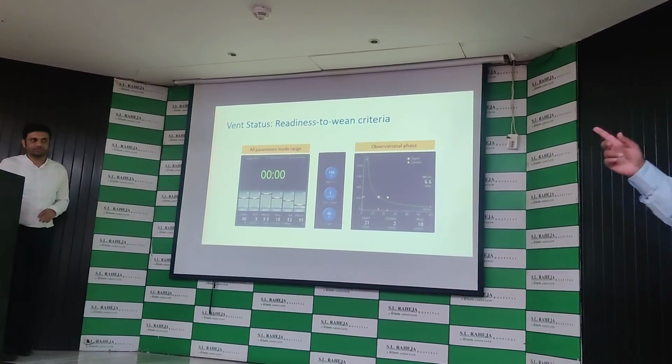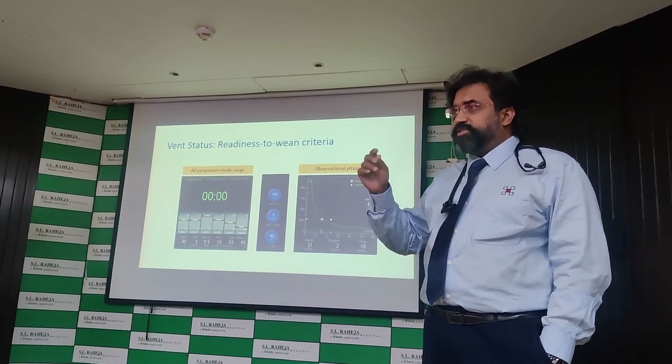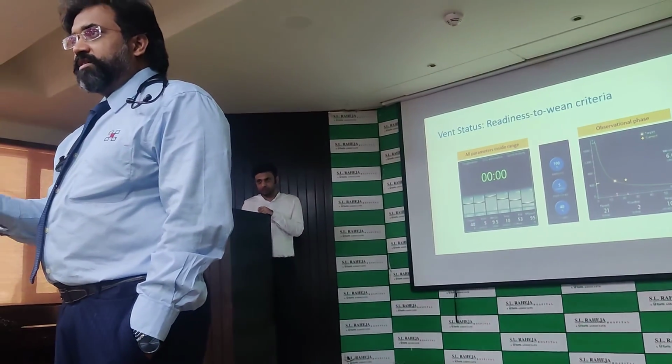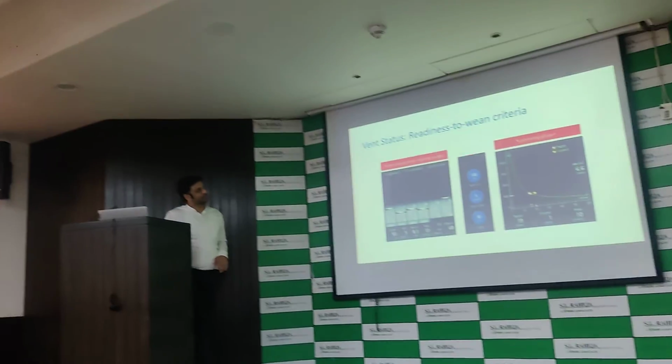So weaning is simple, but tackling the distress is a little bit difficult, because you have to stand with the patient and go up. Yeah, that's the point. But still, it is much easier than otherwise. You only have one parameter changing. You cannot change anything more.